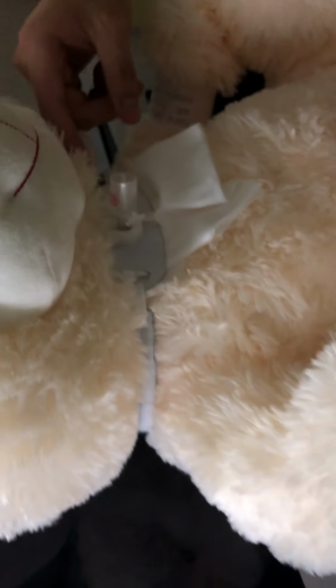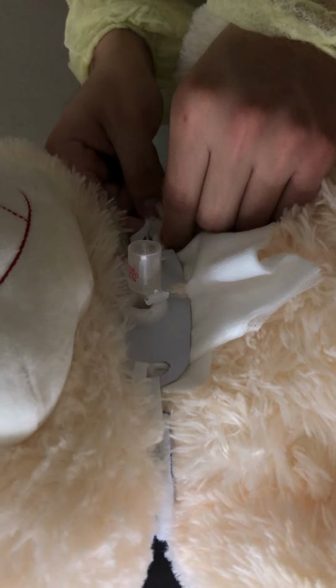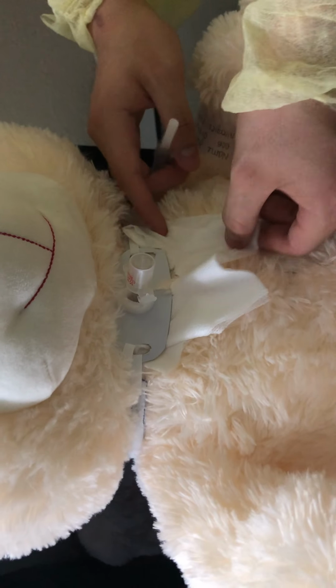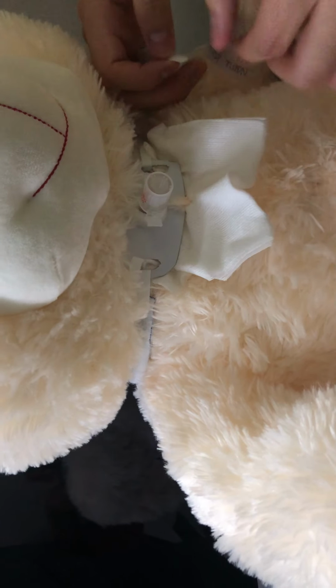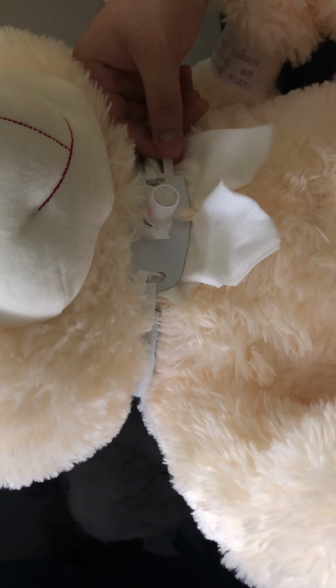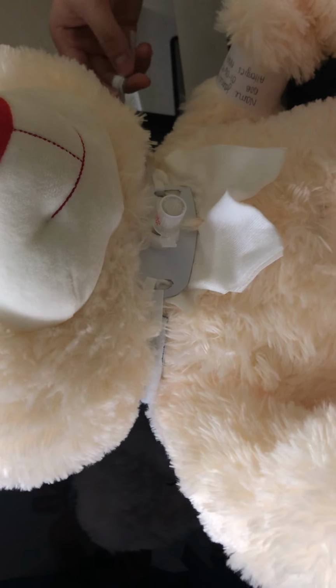I'm going to remove the old twist tie now. As you can see, it accidentally pulled on that. In real life, it wouldn't be pulling on it. Because of that pull, it messed that whole thing up. We could disregard that. It wouldn't actually happen in real practice. And if it did, we're lucky it was a simulation. Remove the old one.